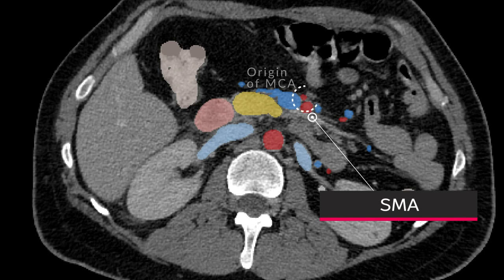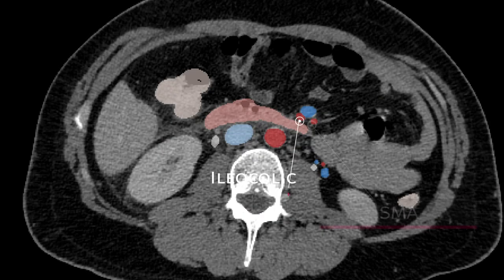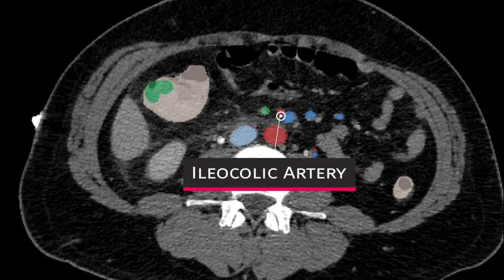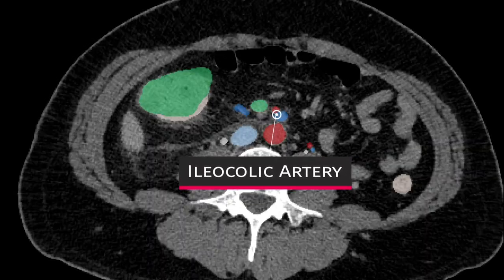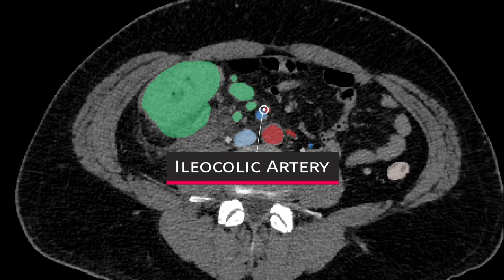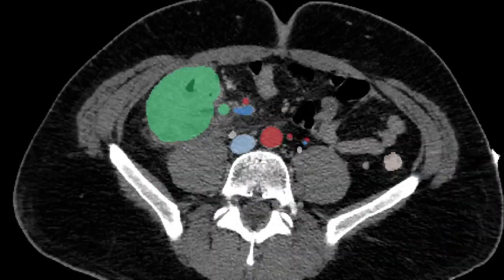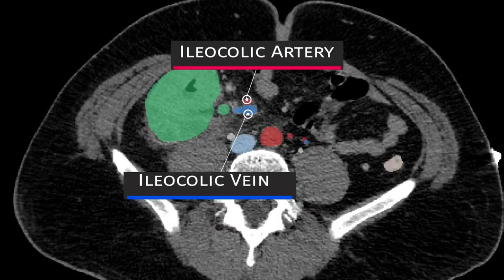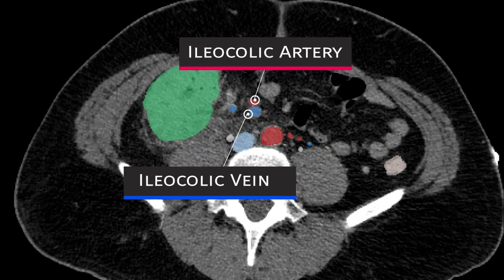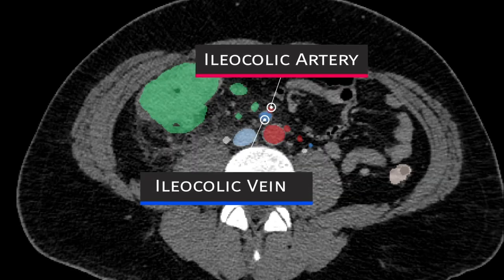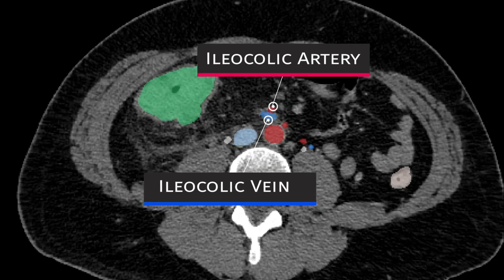The SMA can be followed further distally to identify the origin of the ileocolic artery, seen here passing dorsally to the SMV. This can be traced as it passes inferolaterally to the right lateral aspect, towards the cecum and proximal ascending colon. The ileocolic vein can then be identified as the vessel accompanying the artery and traced back to its insertion into the SMV.